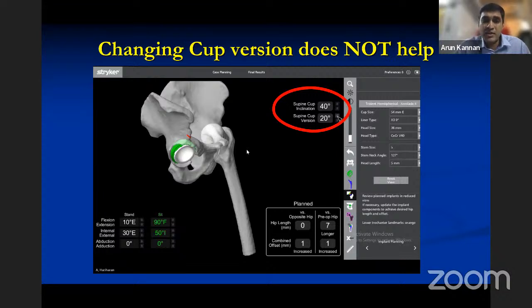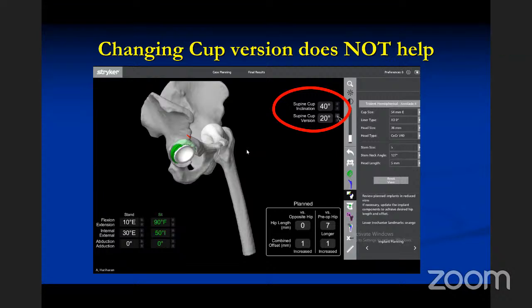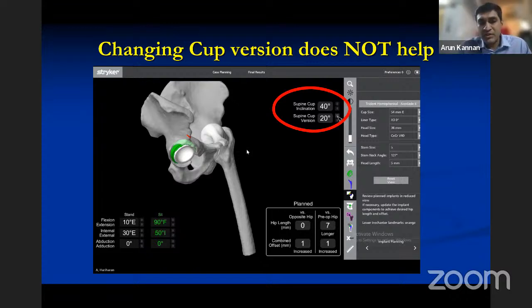What you target intraoperatively, the patient may not achieve all that movement. They also target 120 degrees flexion. That is also fairly common, quoted in literature: 120-degree flexion and neutral rotation. That is another common target mentioned in literature. Flexion is okay. Flexion is acceptable in Indian patients. I'm talking about only the rotations. Yeah. Rotations. Sir, that's a personal opinion that you have, sir.